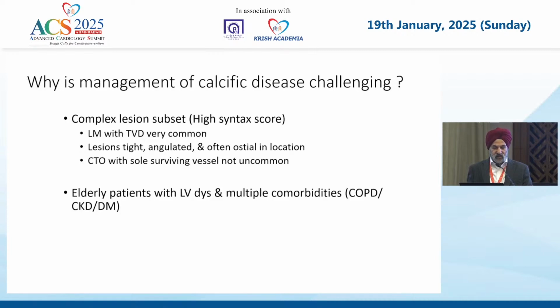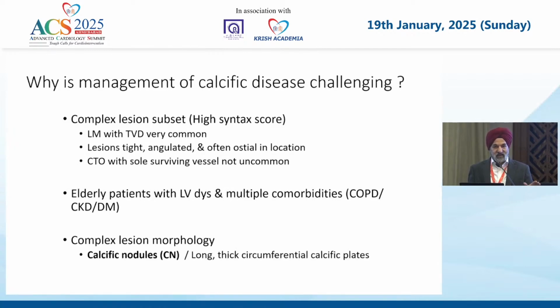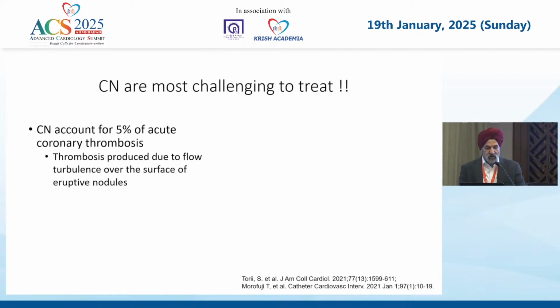CTOs are not uncommon. Most importantly, these patients are elderly. They have multiple comorbidities: COPD, diabetes, CKD. It's not uncommon. And if you look at the lesion morphologies, calcific nodules and thick circumferential plates, it's these morphologies which make the procedure even more complex.